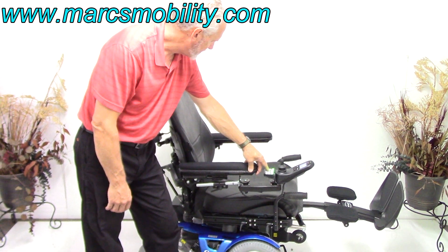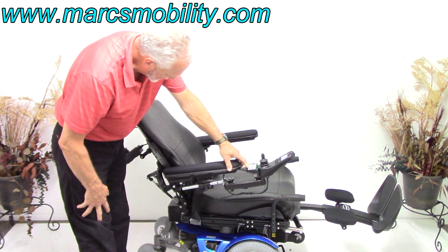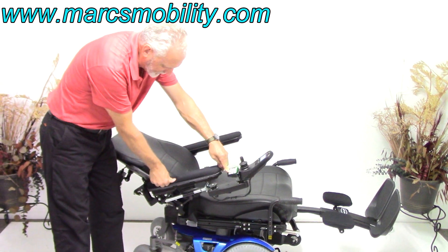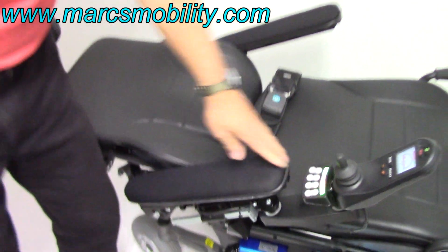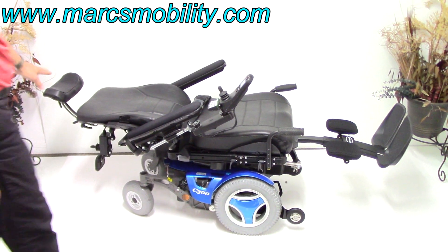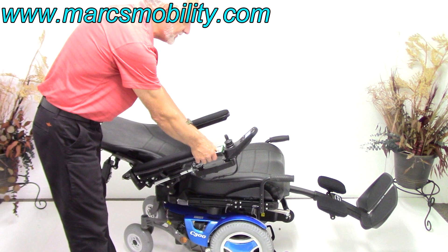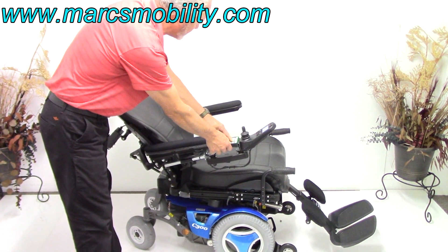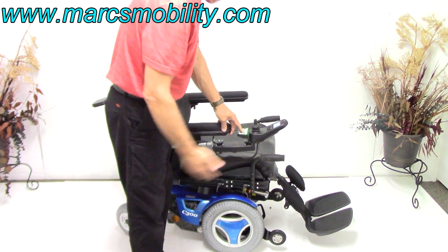Now we've got the seat all the way down. The third button in the sequence is the electric recline — this is just the back going back. So now we've got the electric recline going back. These are gel arms — you can see this is gel, all filled with gel. Very nice, 16-inch gel arms. This would be the fully reclined position, legs up in the air, laying flat — your total flat position. You can do any function, any degree, any position you want. If you're outside, always make sure you leave your legs at least somewhat extended for more room.